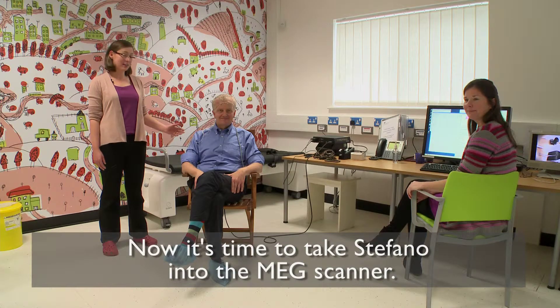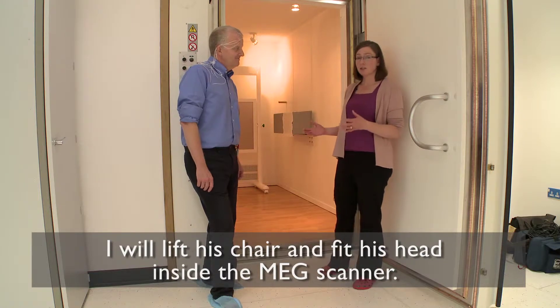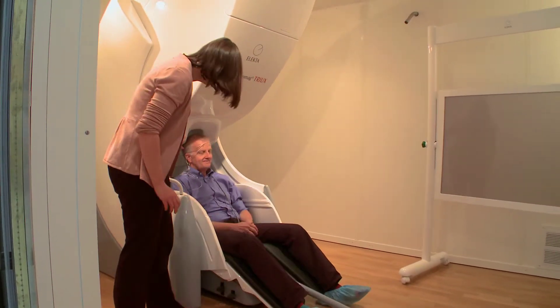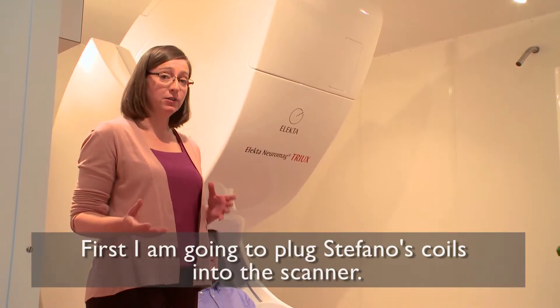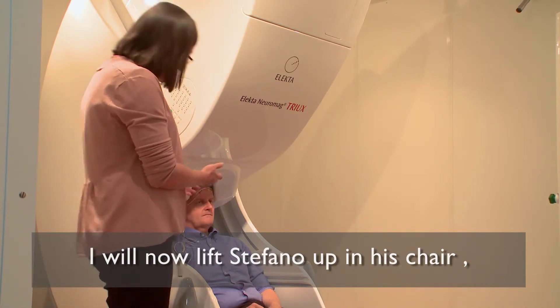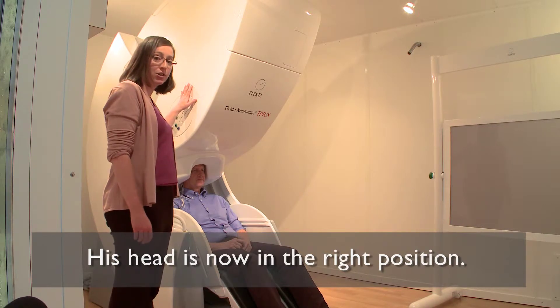Now we're all finished with our preparations and it's time to take Stefano through into the MEG scanner. The MEG scanner is inside this room, so I'm going to take Stefano through, ask him to take a seat in our chair, and then slowly lift him up so that his head is inside the MEG scanner. First I'm going to plug Stefano's coils into the MEG system, and then raise him up in his chair so that his head is inside this helmet here. His head is in the right position now so we're ready to record.